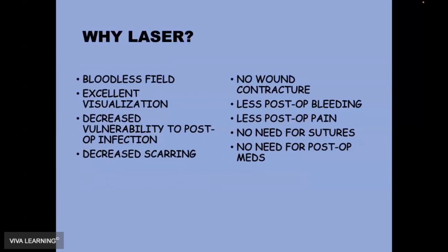Why laser? Gives you a bloodless field, excellent visualization of the field, decreased vulnerability to post-op infection, decreased scarring, no wound contracture, less post-op bleeding, less post-op pain, no need for sutures, no need for post-op meds. These are just some of the many, many reasons why a laser biopsy in many hands is preferable to a scalpel biopsy. But once again, at the end of the day, you've got to be fully trained in the device or technique that you're using.